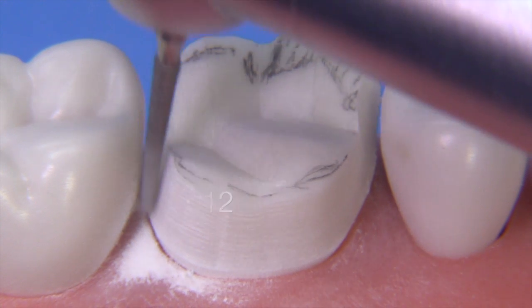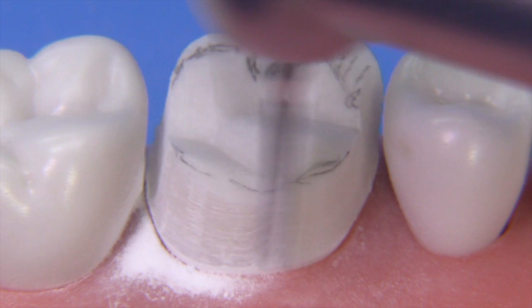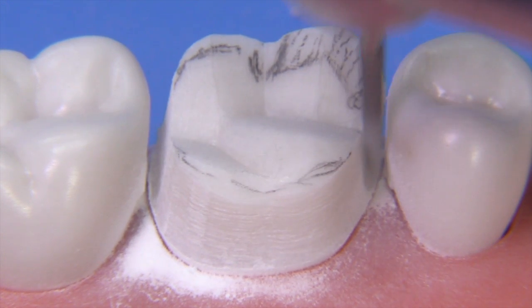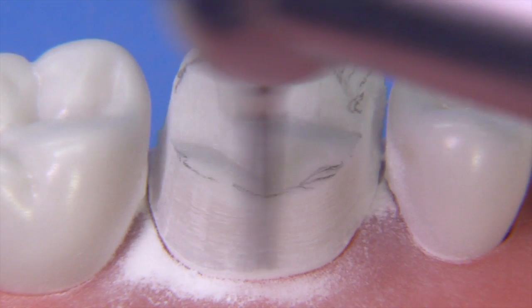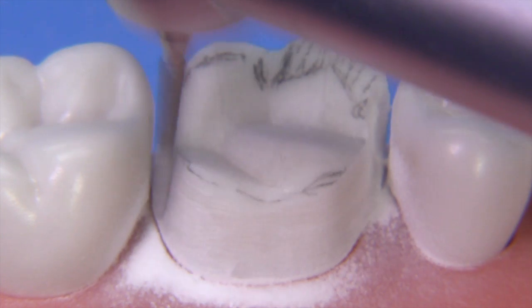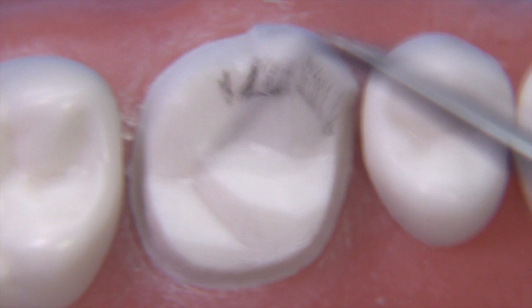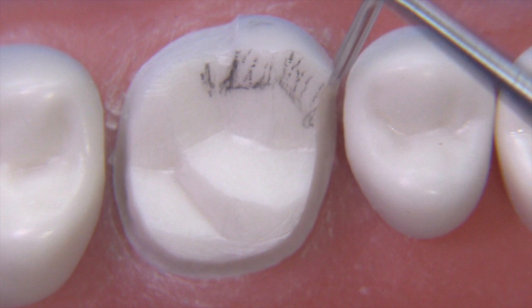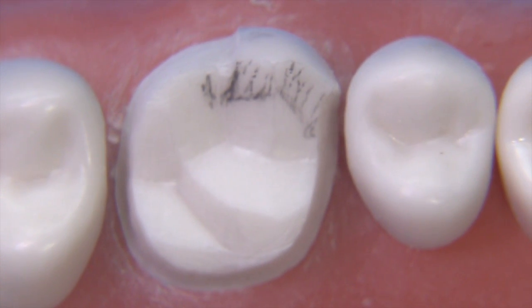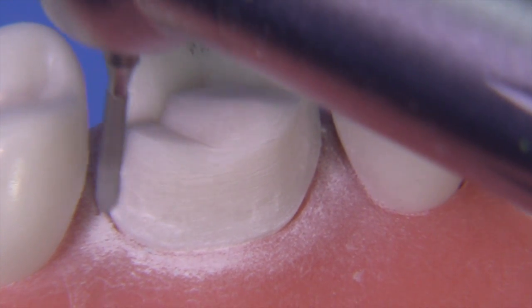Now I'm moving back to the 878K 012. We've created a lot of irregularities interproximally — some disturbances in the uniformity of the preparation form. I like to go back around at this point, fix the taper, make it uniform, look for areas where the finish line is not uniform above the tissue, look for areas where you may have an undercut or over-tapered, and make corrections before going on to finishing the chamfer. Axially it's probably not deep enough yet, but I can see the finish line all the way around. We probably want a little bit more clearance on the facial for easier finishing of the gold when we cement and finish with discs.